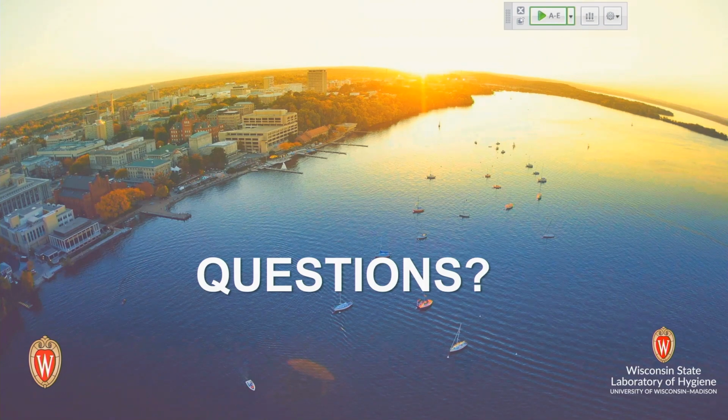Yeah, I guess we don't perform it at our institution. We did work it up. I would say comparatively to culture, it matched pretty well with culture. There were some things we found on the multiplex lower respiratory panel that helped guide culture workup, but ultimately it doesn't preclude the need for culture, because so much of what we find in culture we end up going down the road of doing susceptibility testing for, that you're still going to have to do culture, especially depending on what you run into.